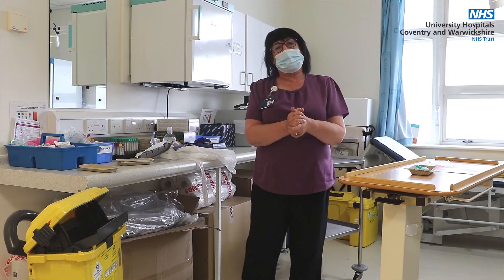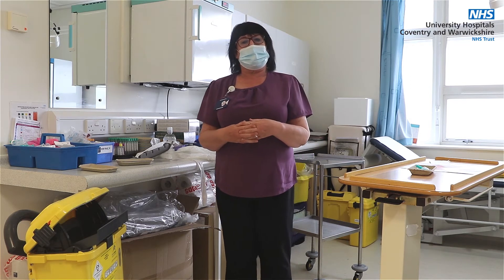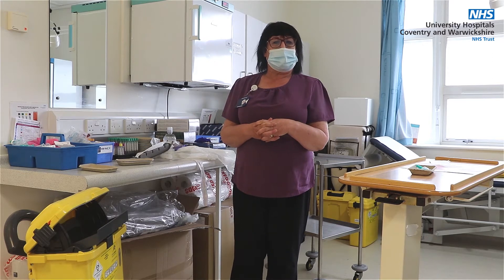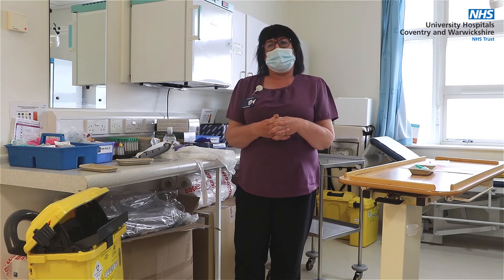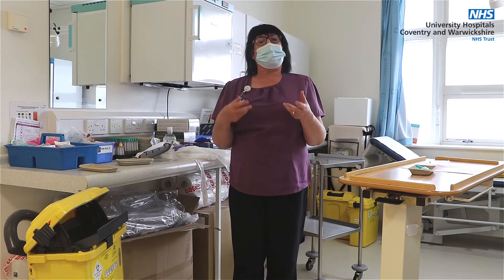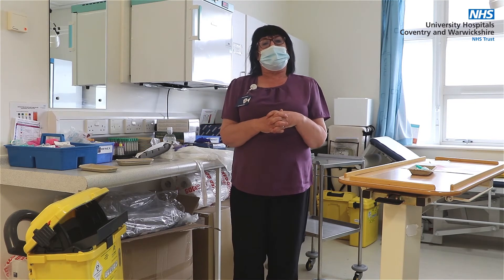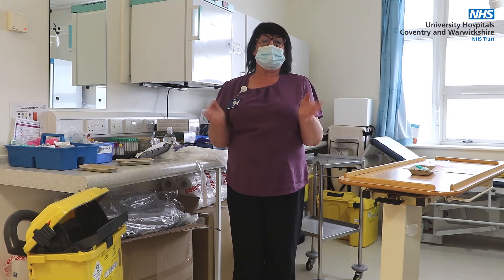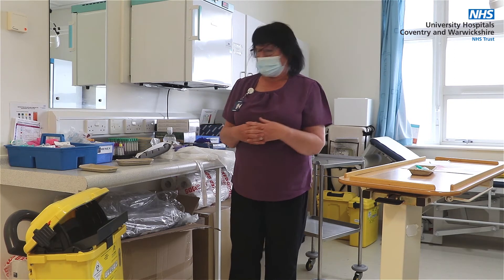Then I'll think about the equipment I'm going to need. What safety equipment is available to stop me having an injury? Do I know how to use it? Have I been trained? For most procedures there are safety devices such as safety needles, and you should look into them before you undertake the procedure and make sure that there is availability within your area.